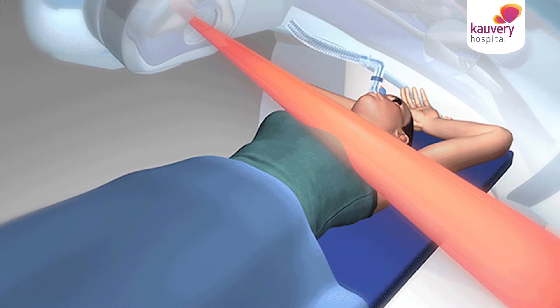How do these radiation x-rays act? They are directed at the region or place where the cancer is diagnosed. For example, if a person is suffering from breast cancer, usually post surgery, the area where the tissue or the cancer was diagnosed is planned and x-rays are directed at that region. There are DNA breaks which happen in the cancer cells, and cancer cells are more susceptible to radiation therapy damage than the normal tissue. Hence, we use this as an advantage when we use radiation.